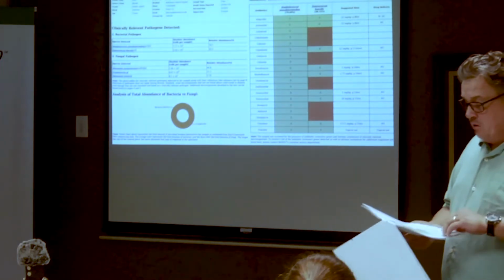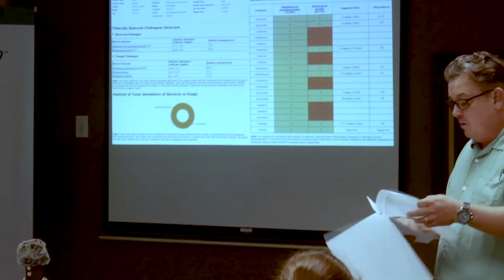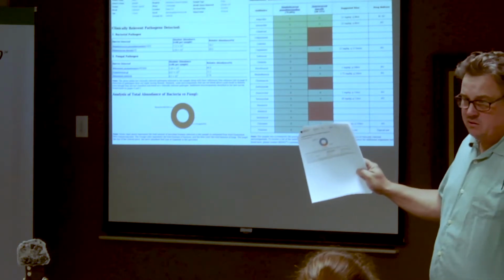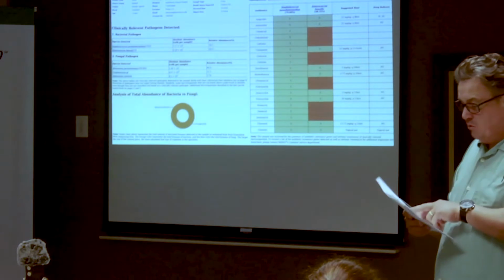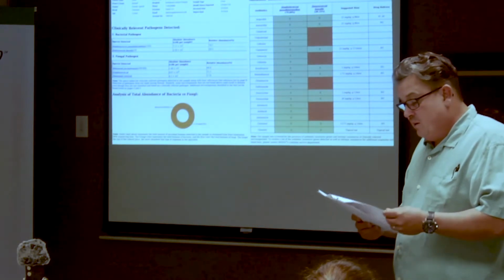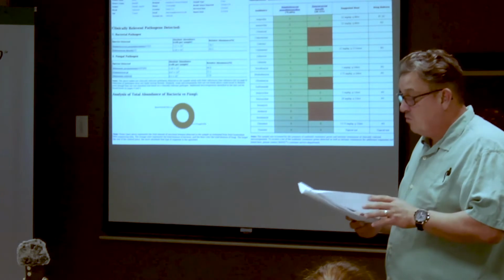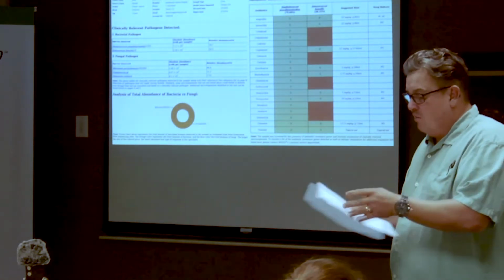So those are the 2 main pages I look at. But as we get more and more of the following pages, if you go to this one here, bacterial analysis, that quantitates how much bacteria was there. It was only 20% Enterococcus off this one, and 80% staph still. But when I treated for the Enterococcus, obviously I treated the staph at the same time, and it worked really well. And then the next page is the fungal composition.